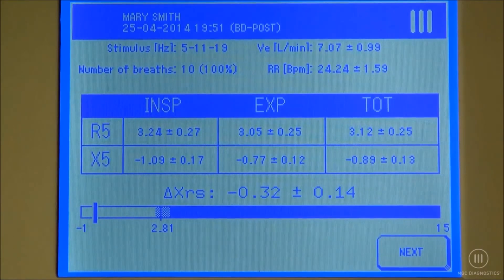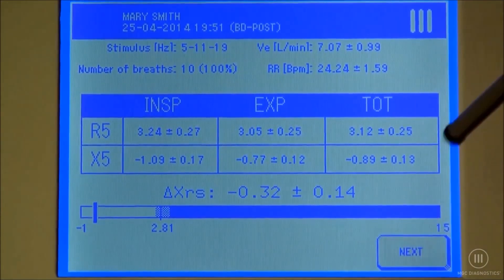The same as in pre, our numerical data will be displayed. Selecting next will display our graphical data.